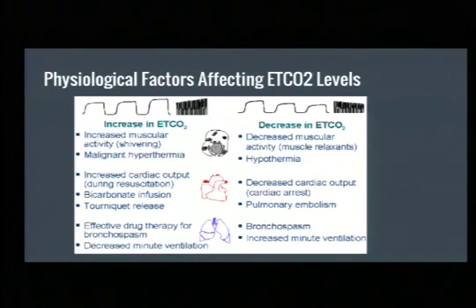So think about that: if there's some big trauma patient that you've made some big change in, that might change the blood flow to lots of tissues. It may not be your actual ventilation that's changed. If they're an asthmatic or COPD and you give your neb, all of a sudden you see improvement in their end tidal, and decreased minute ventilation, so a slower respiratory rate.